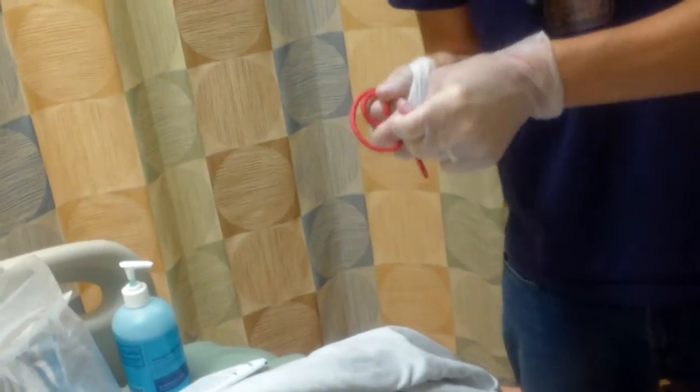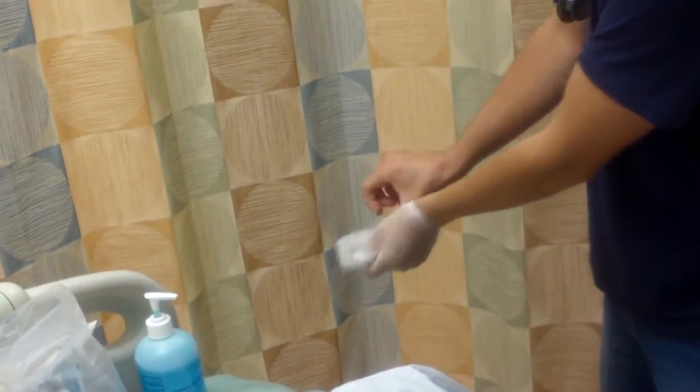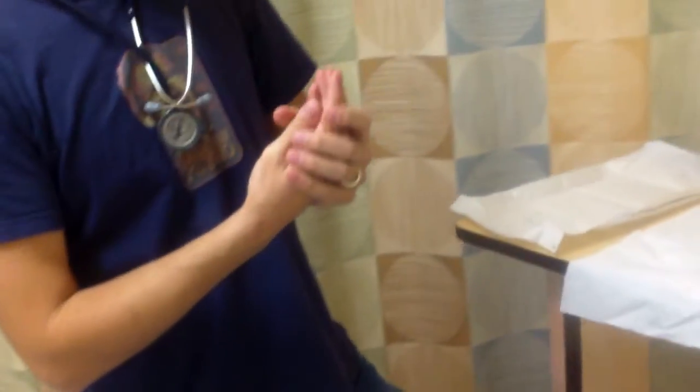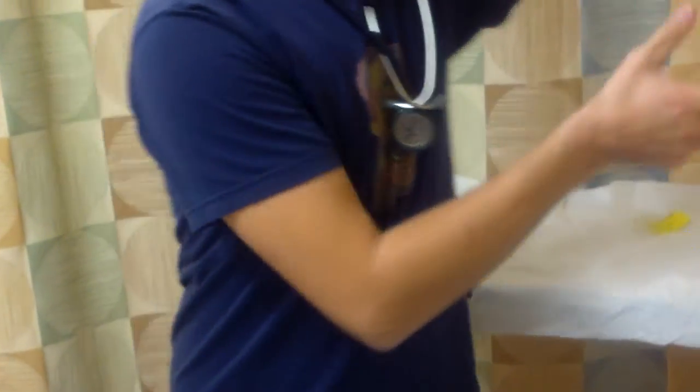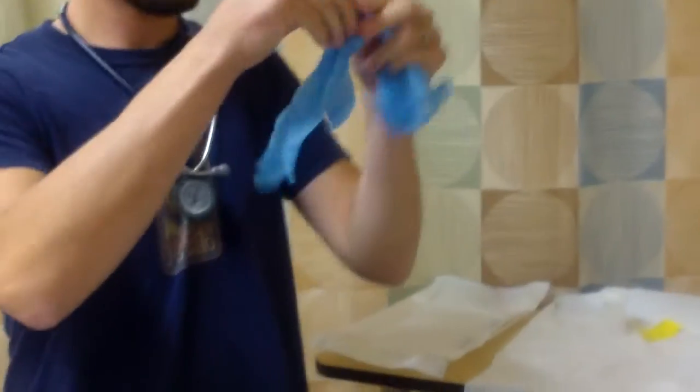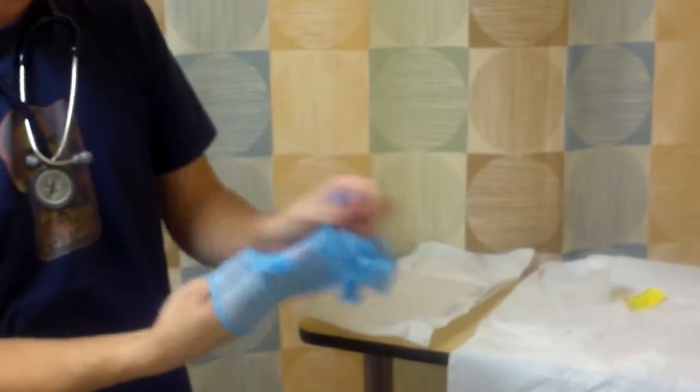Hopefully I can get this thing in here. Let's do it away from the patient and away from me. Do that. Then hand hygiene. Okay, good. And then I want to grab some other gloves, so I'm just going to move my table away. Some gloves right here. Just take 2 of them out. Okay. These suckers back on.